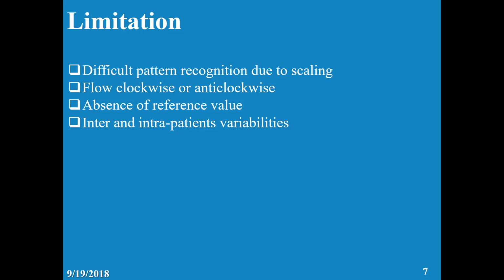Now also there is no reference value, and that's why the trends are important. We cannot look at one breath and say, oh, the tidal volume is high, because there is no reference. You don't know what is high, what is not, what's wrong, what's correct. However, even if it's wrong, the trend changing will give us some information.